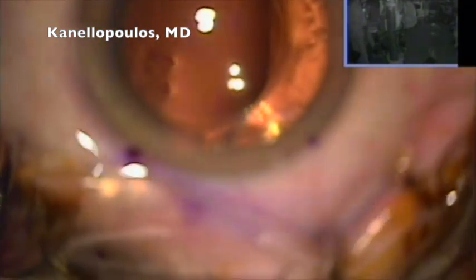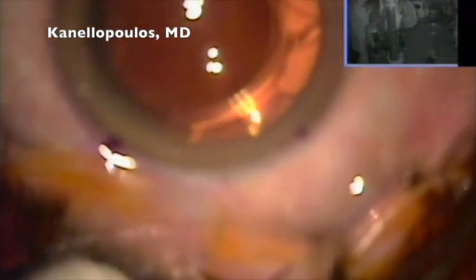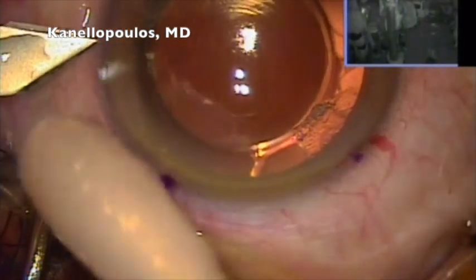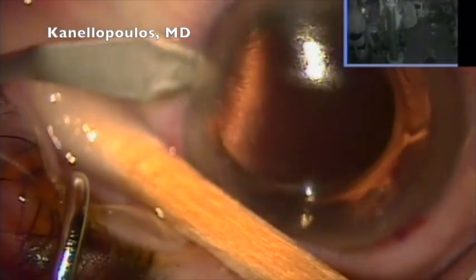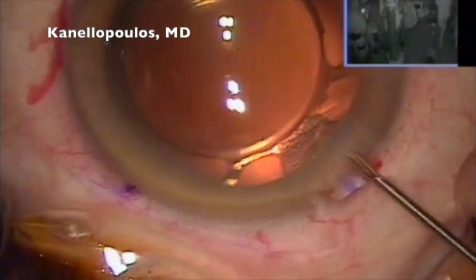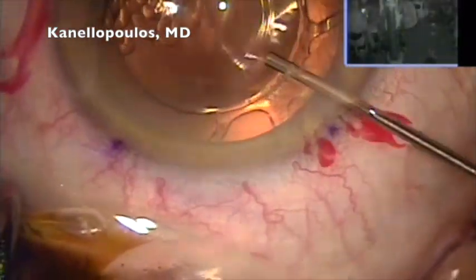So we're calculating here the lens with a goal to be half a diopter with the rule astigmatic post-surgery. Although the procedure was done with a femto, I'm going in at the 135-degree incision, which is my known incision, and I'm very familiar with the astigmatism that I produce. We're playing the video at 4x speed.